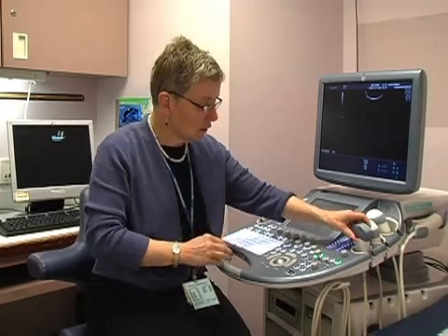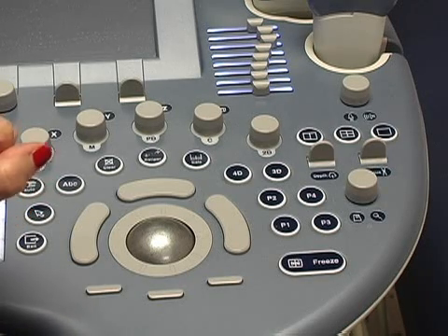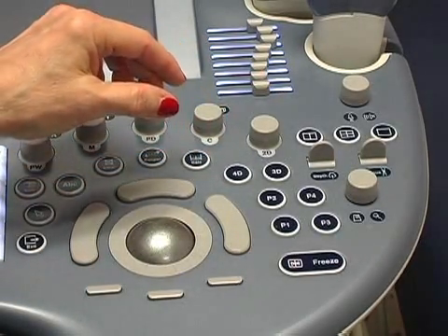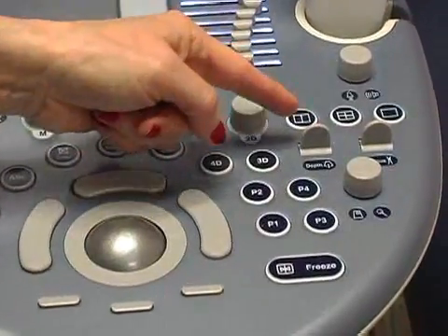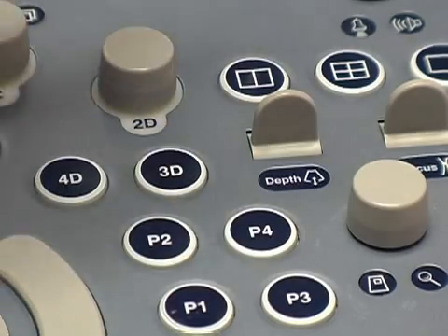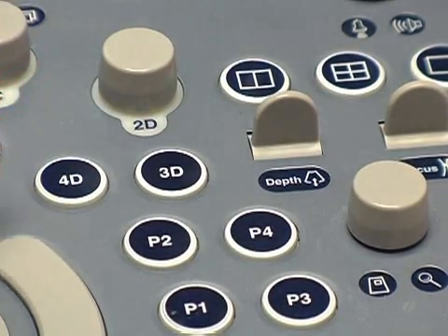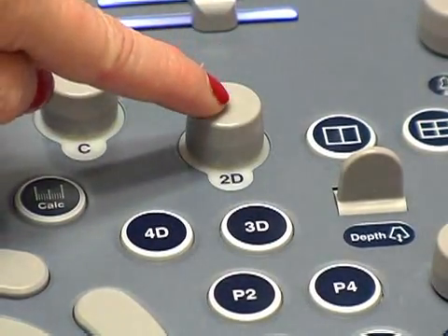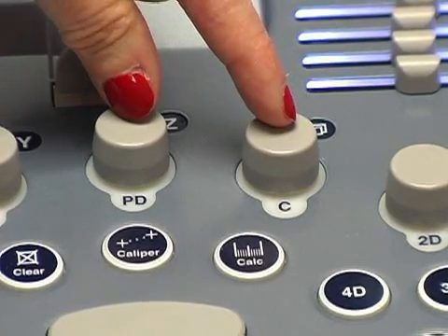If you look at the machine, there are several buttons you can adjust depending on the patient. I'm going to focus on two main things: changing how deeply you are scanning within the patient, and adjusting the brightness of the image, and also color Doppler. The depth button can be adjusted so you're scanning at a very shallow level or more deeply into the patient. The gain button adjusts the 2D brightness — you can make the image brighter or darker. Finally, color Doppler or power Doppler shows blood flow through vascular structures within the patient or fetus.